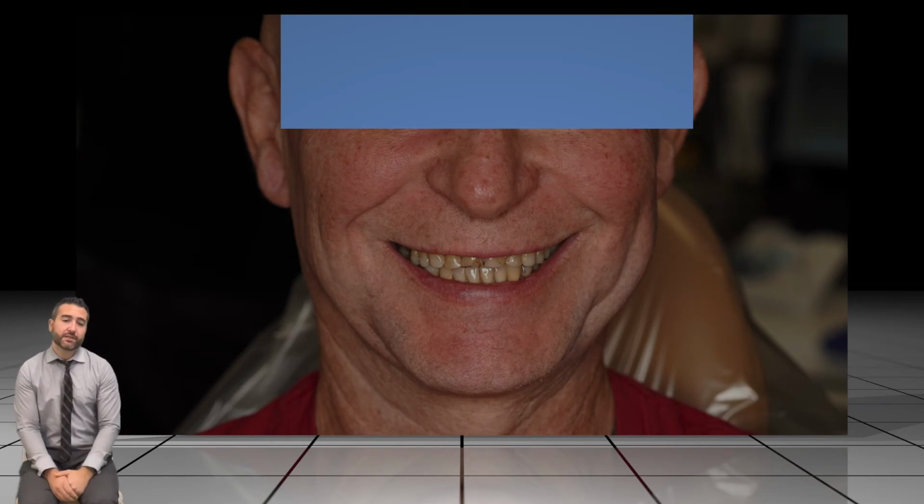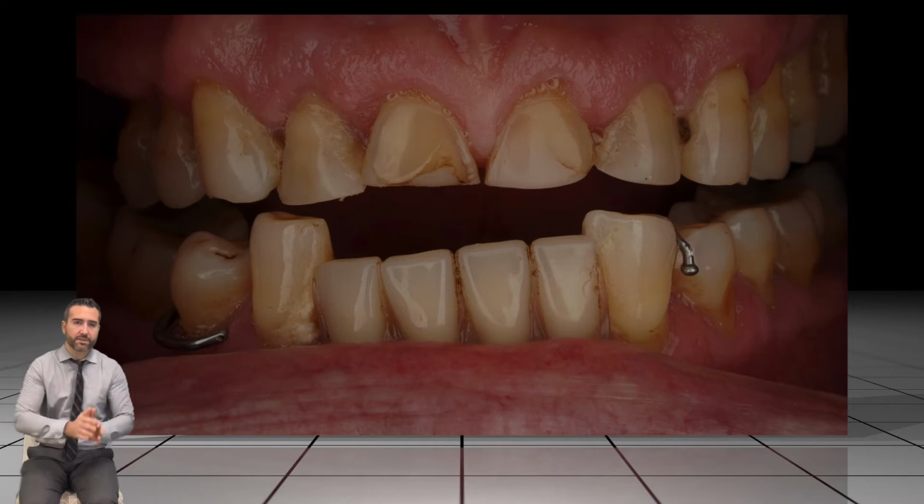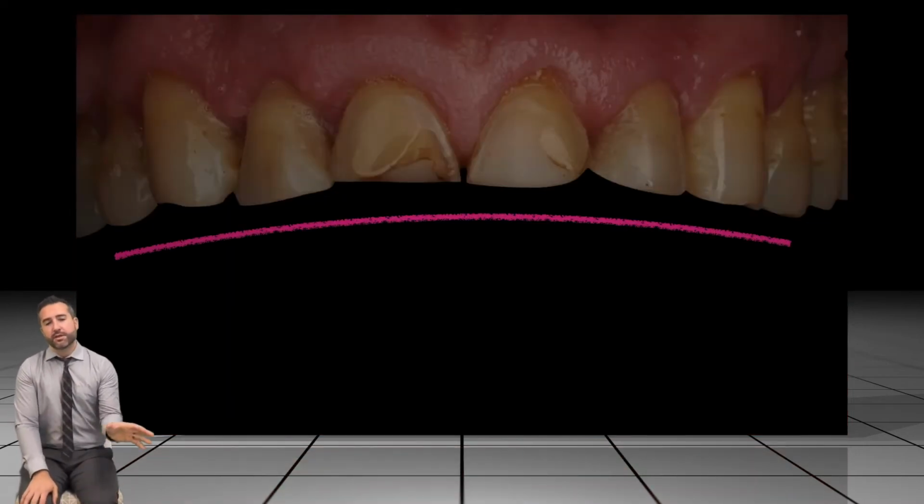What about multiple unit things? Is this the next level of chairside dentistry? I say absolutely. Once you get more powerful softwares and get some puck mills in your office, you could do things like this.